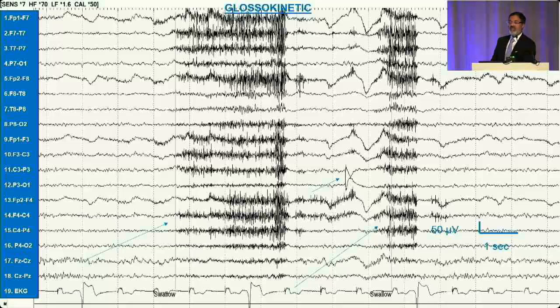These are the front of the eye, the cornea is positive, so when you close your eyes they roll up, something called Bell's phenomenon, and it causes a very prominent activation at the FP1, FP2 electrodes. And because it's positive, the pen deflects downwards, okay? FP1 is more positive than F7. It creates a downward deflection.